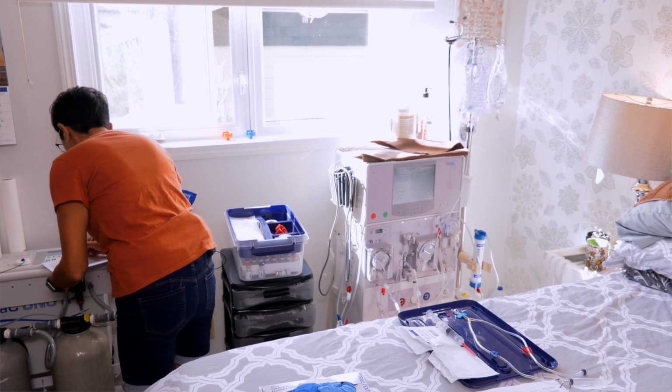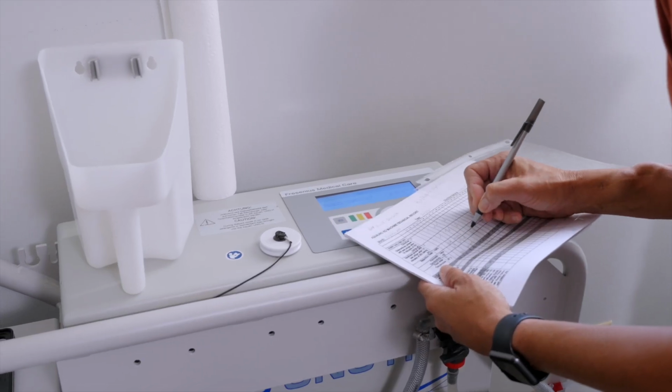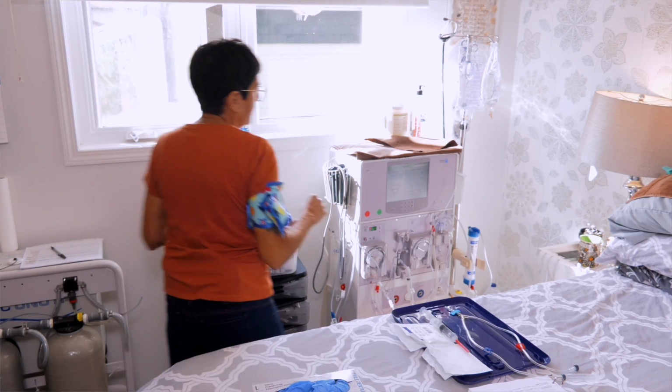So now I have to record daily that I've done those checks, and then some numbers like the conductivity, the temperature of the water, and then we can start.